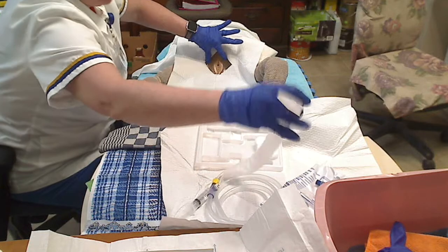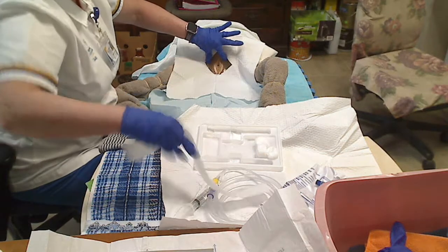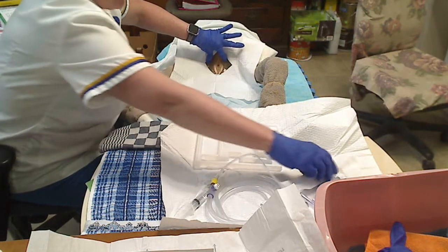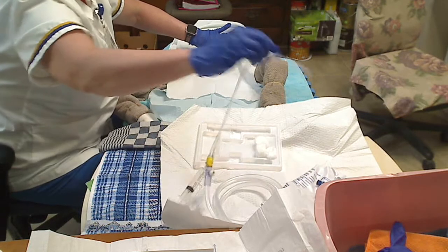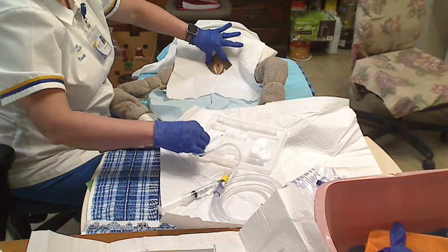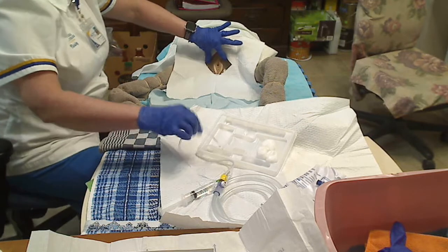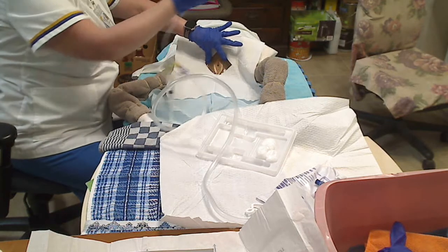My dominant hand will slowly pull apart the catheter so as not to expose the tip of it. Nope, still did not expose the tip. Bring it out of its packaging. Place it within. I could have done that earlier and probably should have done that earlier. I did not break sterility though because it did not touch the packaging. So I am touching it within the lubrication. And then from here, I'm going to bring it all just a little bit closer, and I'm going to explain to Anna the next steps.